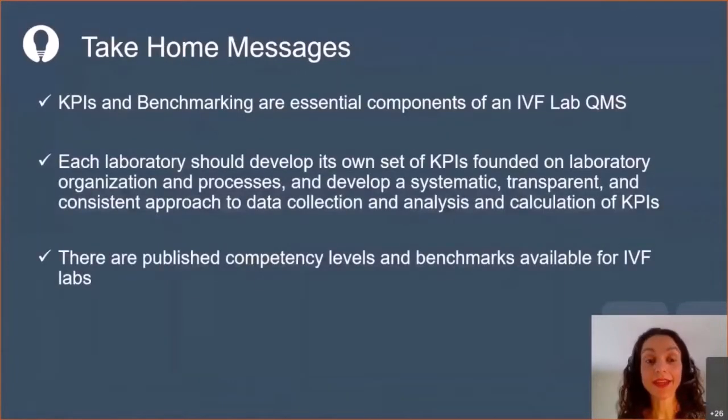With that, I would like to conclude this presentation with 3 take-home messages. First one, KPIs and benchmarking are essential components of an IVF lab quality management system. Also, each laboratory is encouraged to develop its own set of KPIs because it depends on their own lab organization and processes, but develop a systematic, transparent, and consistent approach to the data collection and analysis.